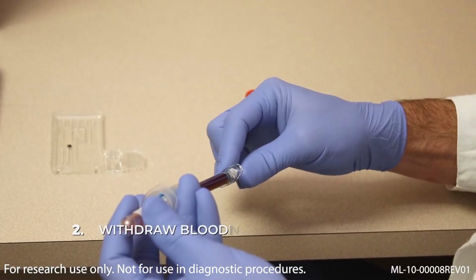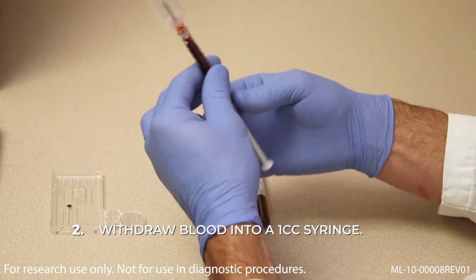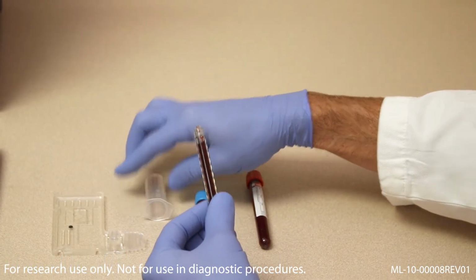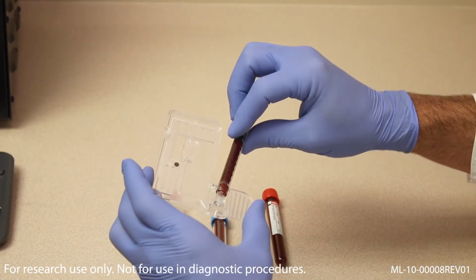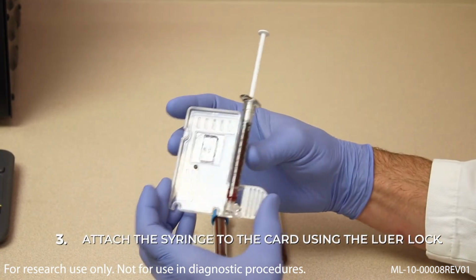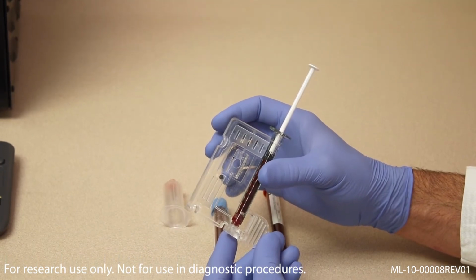2. Carefully withdraw blood from the vacutainer into a 1cc syringe. This can be done with a needleless system as seen here. We recommend at least 0.7 milliliters to run each test. 3. Once the blood is withdrawn from the vacutainer into a 1cc syringe, carefully attach the syringe to the card using the luer lock. Be careful to not inject blood into the card when attaching the syringe.